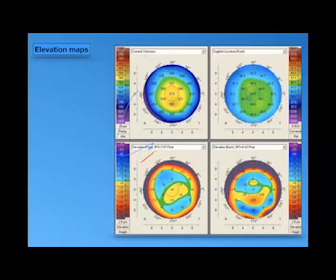It is the highest point, which is at the central part and significant zone of the cornea. So it's highly suspicious. Around there is +10, -7, 0, +2, -10, and so. And there is what's called a tongue-like protrusion in the back of cornea.